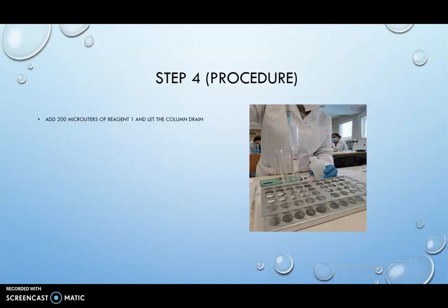Step 4: Add 200 microliters of reagent 1 and let the column drain.